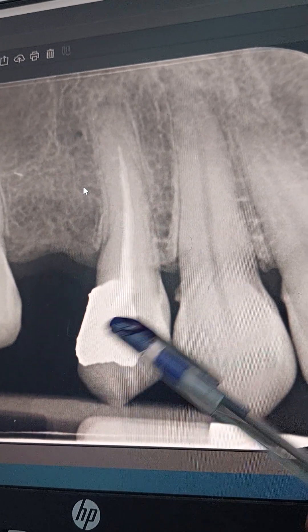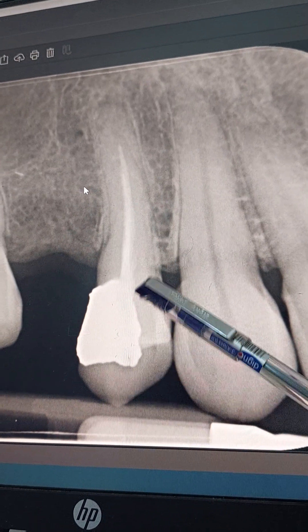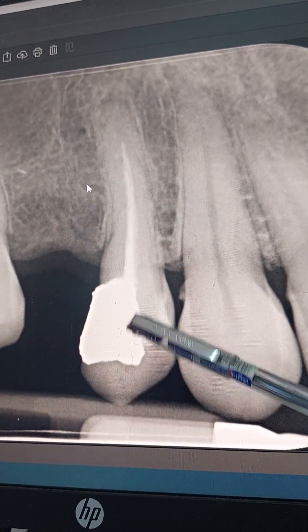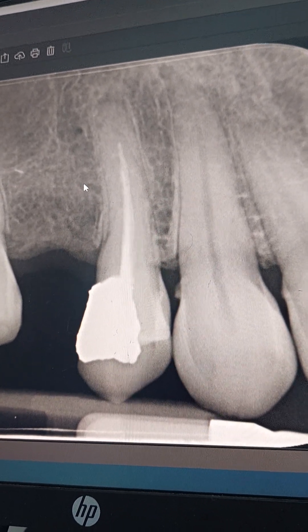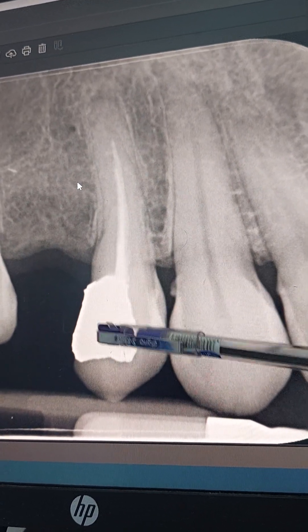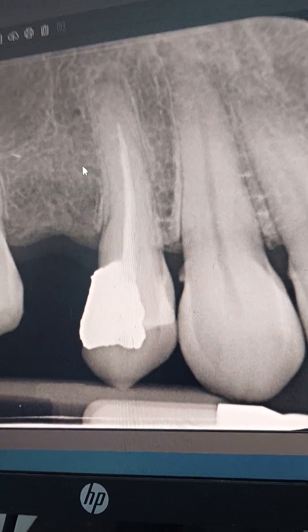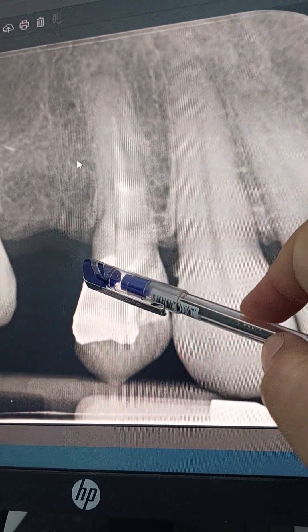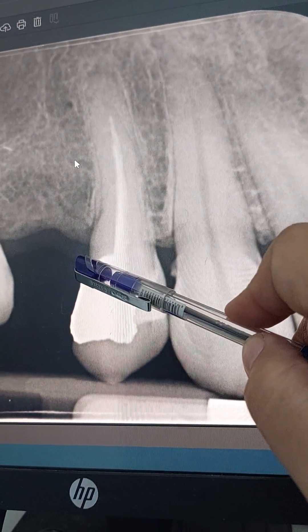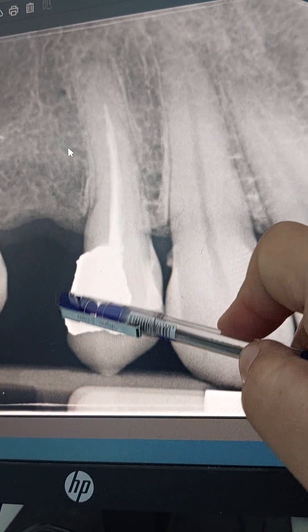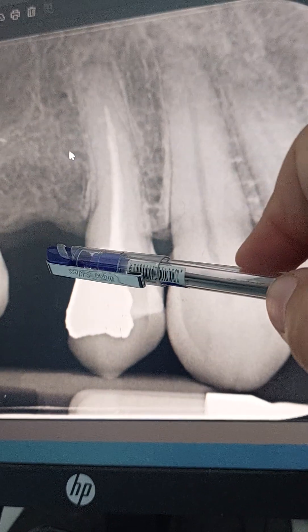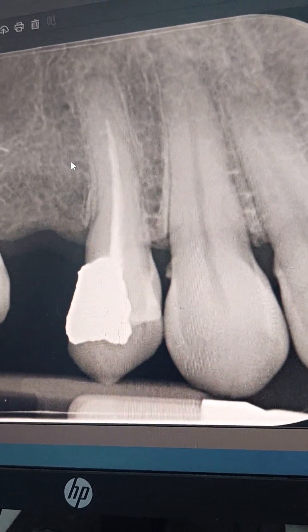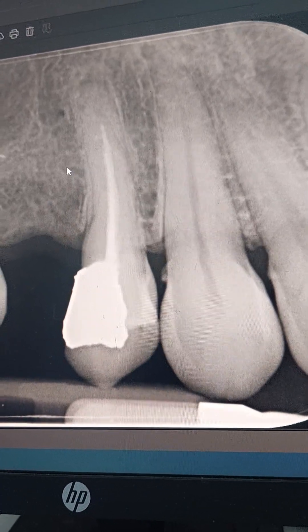This tooth is still standing because it has two cusps. But when I prepare it, what will happen to the coronal structure? The composite filling will be removed, and you might find an even larger cavity underneath. A larger cavity means minimal remaining dentine — not enough for a proper effect. Looking at the margin, it is deep, so I need to ensure I'm placing my preparation margin on clean tooth structure with enough dentine.